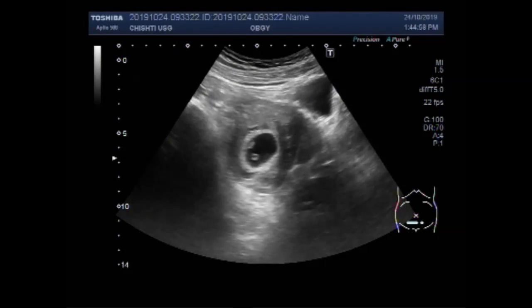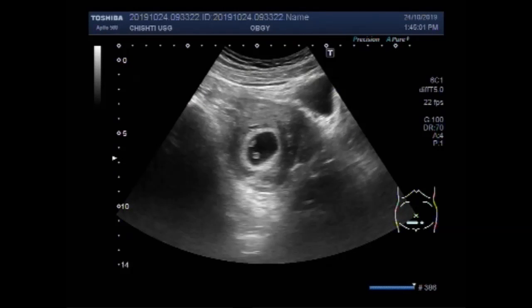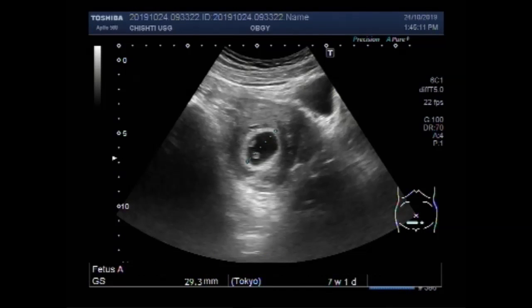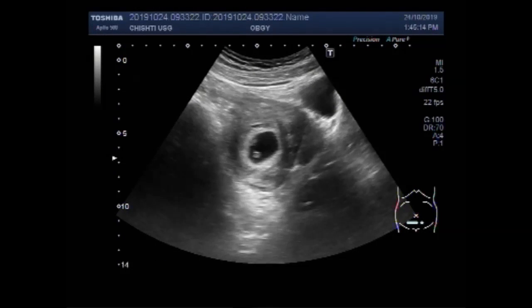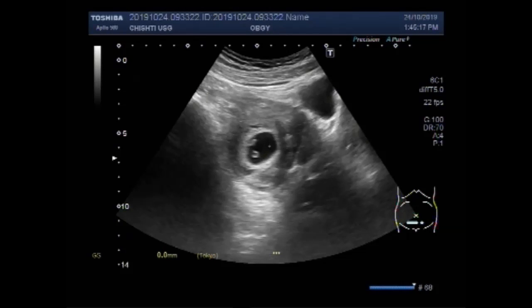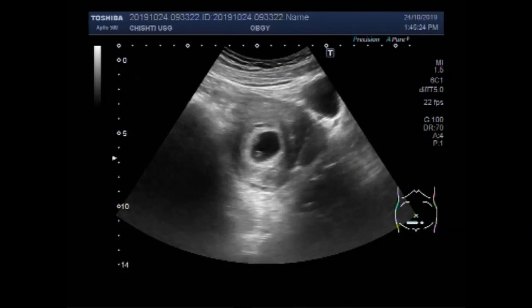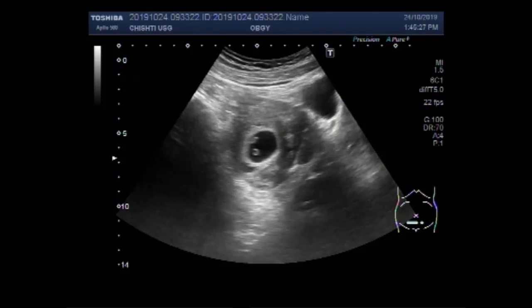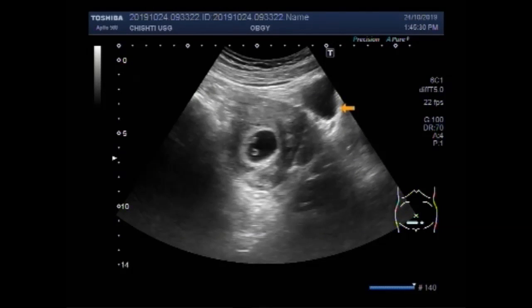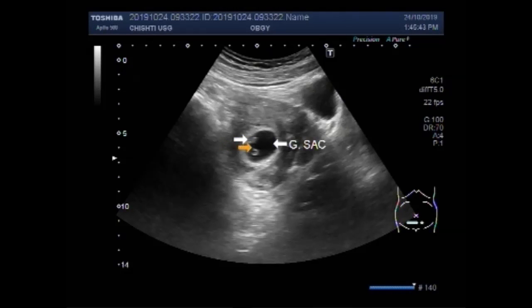Now you can see the gestation sac having a tiny embryo and a small umbilical vesicle. The measurement shows pregnancy about seven weeks, six weeks, five days. Now you can see this is the gestation sac, and this is the tiny embryo.